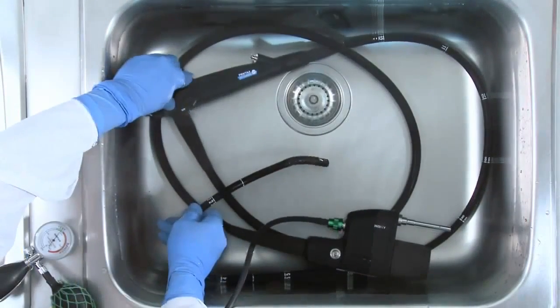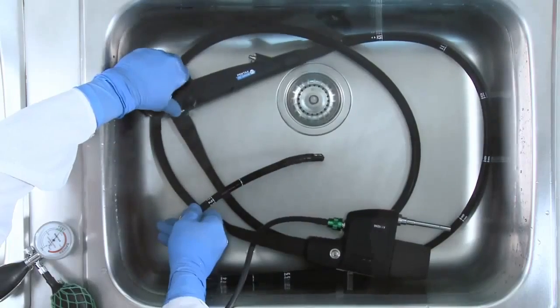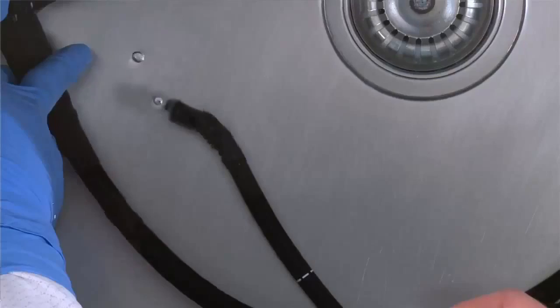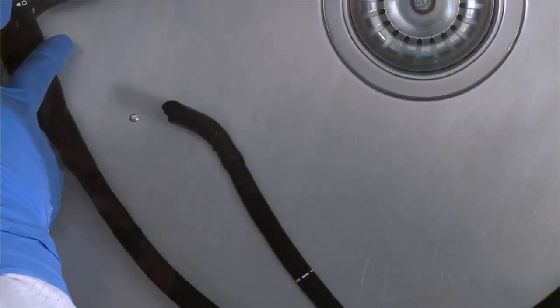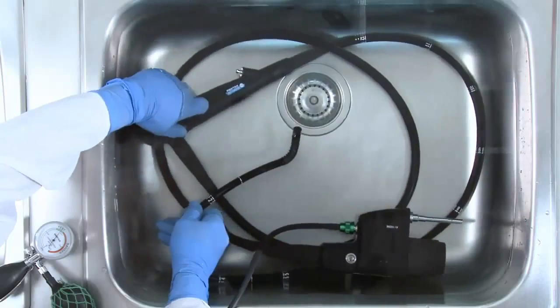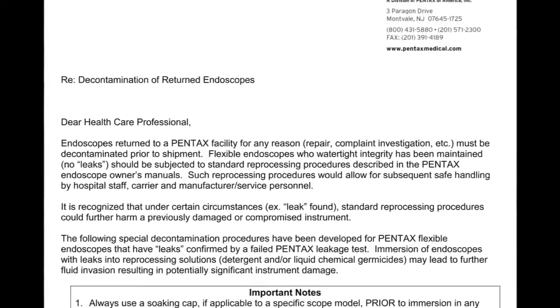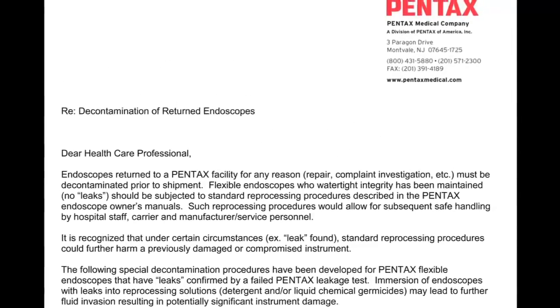Next, deflect the distal tip in all directions while alternately looking at the leak tester gauge for movement of the needle and looking for bubbles in the water, particularly on the exterior of the bending rubber. If you discover bubbles that do not stop after a few seconds, remove the endoscope from the water and reprocess the instrument as per the PENTAX position statement KN-111 Revision D, Decontamination of Returned Endoscopes.